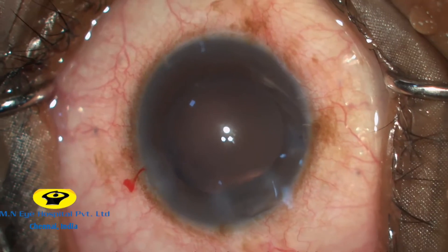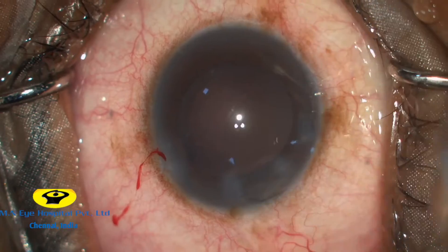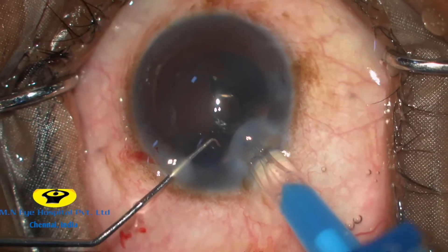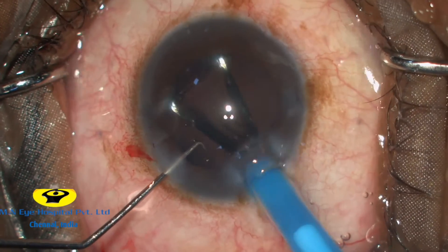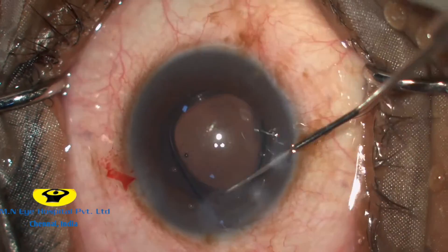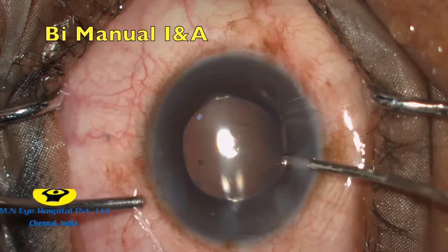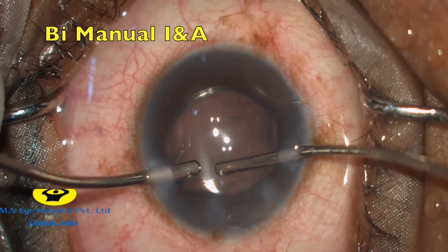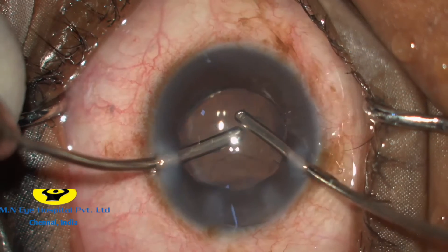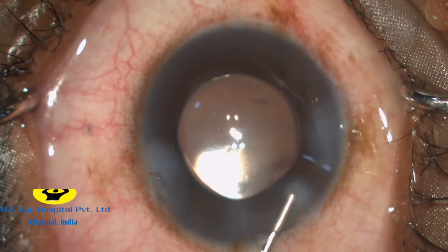We don't have much cortex in these hard cataracts. A single-piece acrylic foldable intraocular lens is gently injected into the capsular bag and dialed into position. The viscoelastics are washed away and the side ports and main wound are hydrated.